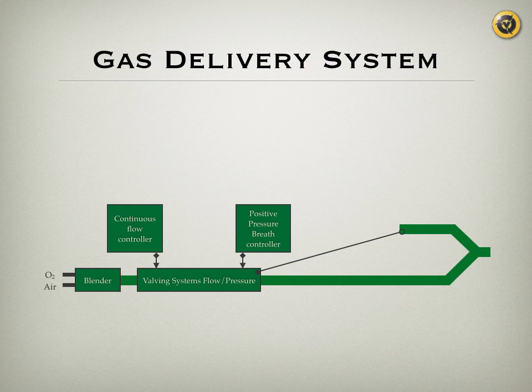Now, to control those two, you cannot directly control them unless you have knobs. And so those are the knobs they put on the front of the ventilator. Now it's touch screen and other things. But the idea here is to set the mode, to set how those pressure breaths will be set and how the continuous flow control will be set. You need the mode controllers. And the mode controller also will modify the behavior of the expiratory valve control.